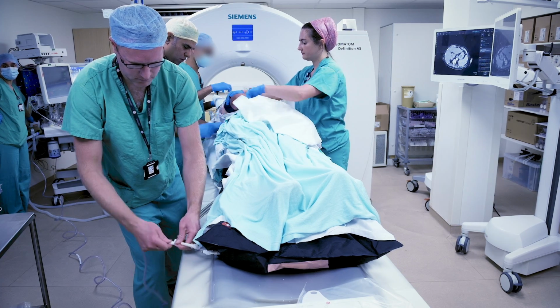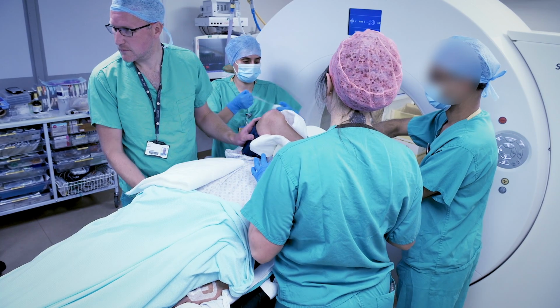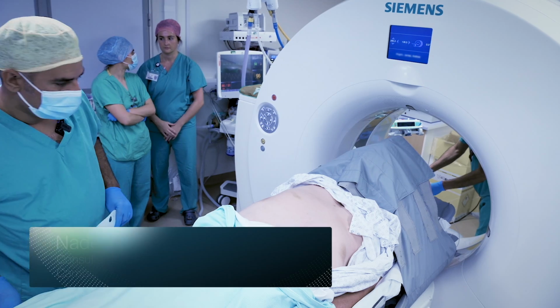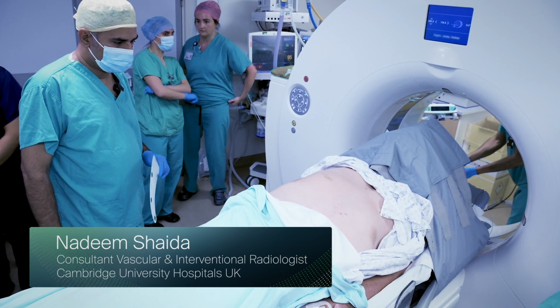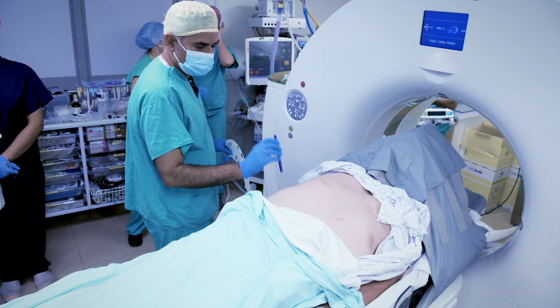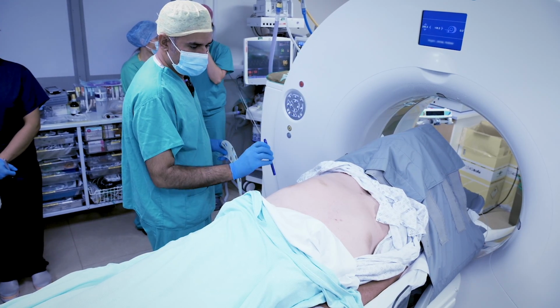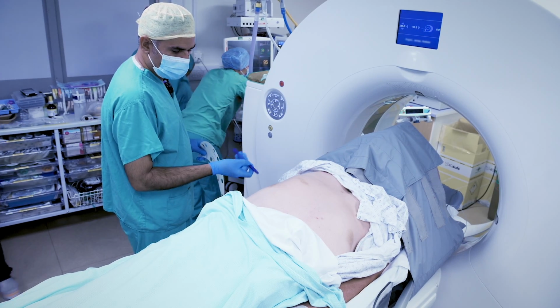He's been anaesthetised, it's under GA. We have a hard board with a vacuum mattress just to immobilise him in place. We have turned him ever so slightly left side down, right side up, because it's a posterior lesion, and I think that the angle that will be needed will be aiming directionally downwards, so I want enough room and enough space to get that in.